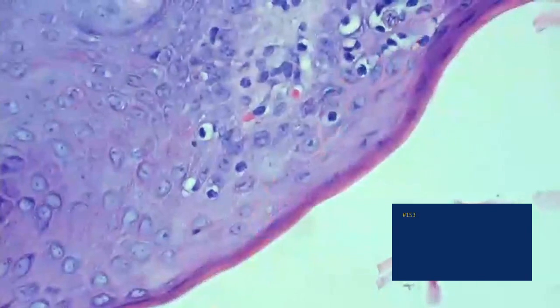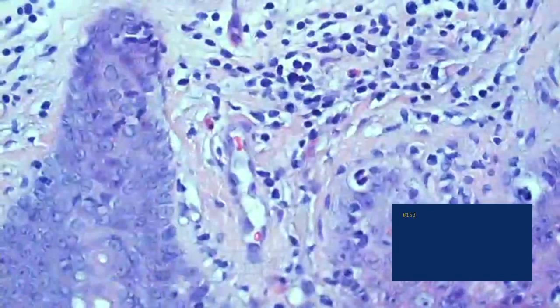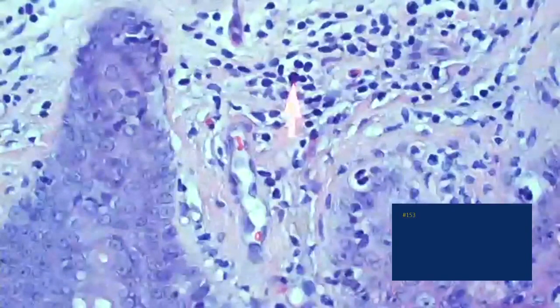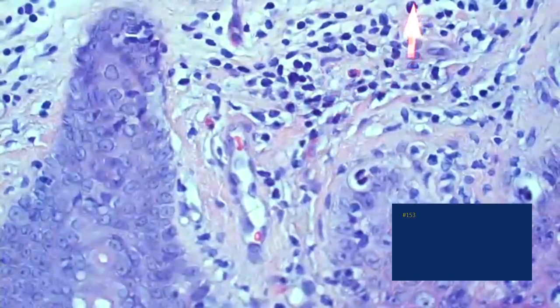They tend to be larger in the epidermis than they are when they're in the dermis. It's not 100% true, but it tends to be true. Just think of them as when they get in the epidermis and kind of swell with pride a little bit. But that's a pretty large atypical cerebriform lymphocyte right there. There's another one, looks like somebody's brain there.